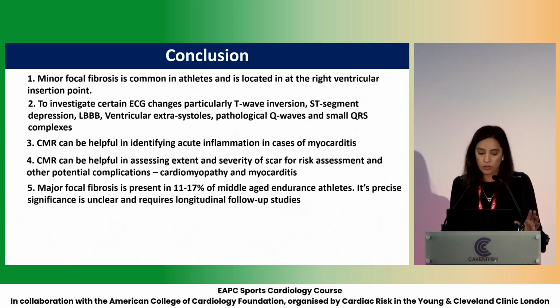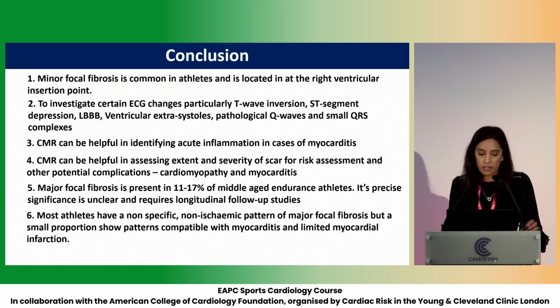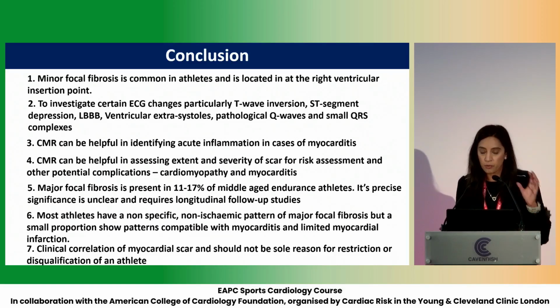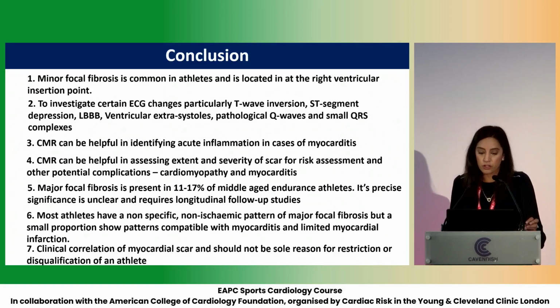We need to gather longitudinal data, and this is where registries will become really helpful. Most athletes have a non-specific, non-ischemic pattern of major focal fibrosis, but a small proportion may demonstrate features compatible with myocarditis or limited myocardial infarction. I think it's really important that we clinically correlate the myocardial scar and don't just use what we see on MRI as the sole reason to restrict or disqualify an athlete. Thank you very much.